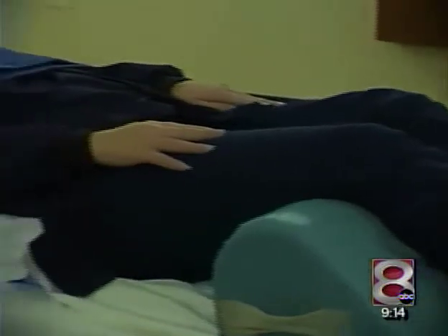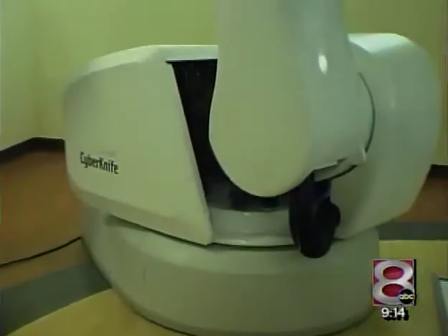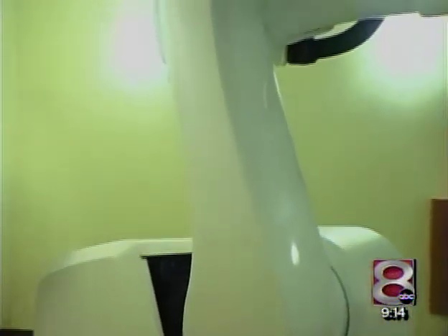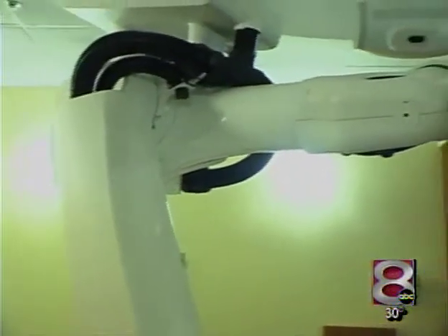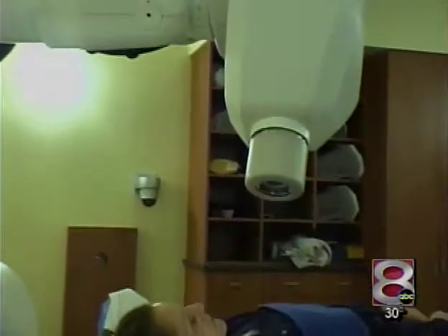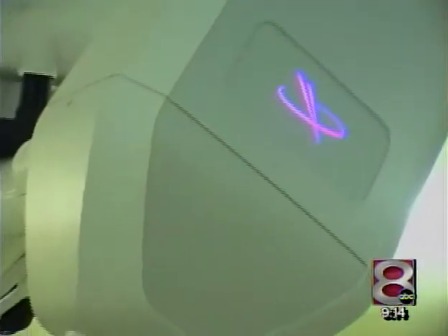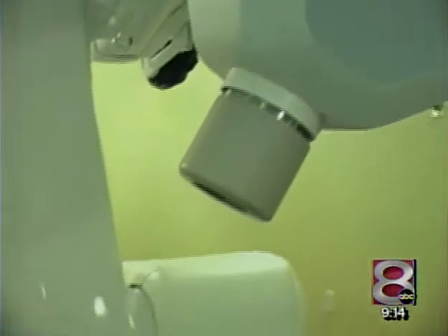Okay. And then explain the video that we're looking at here. Is this basically the procedure? This is a patient getting ready to be treated. There are no knives, there's no blood loss, there's no anesthesia, there's no frame to hold the patient's head. But what we do have is a robotic arm that delivers this computer-driven radiation. It's painless. The patient lies there. We often put a mask on their face to hold their face in exactly the correct position. The computer in the machine can account for breathing. It can account for any subtle, slight movements the patient makes. That's what makes it so revolutionary and allows it to be so accurate.